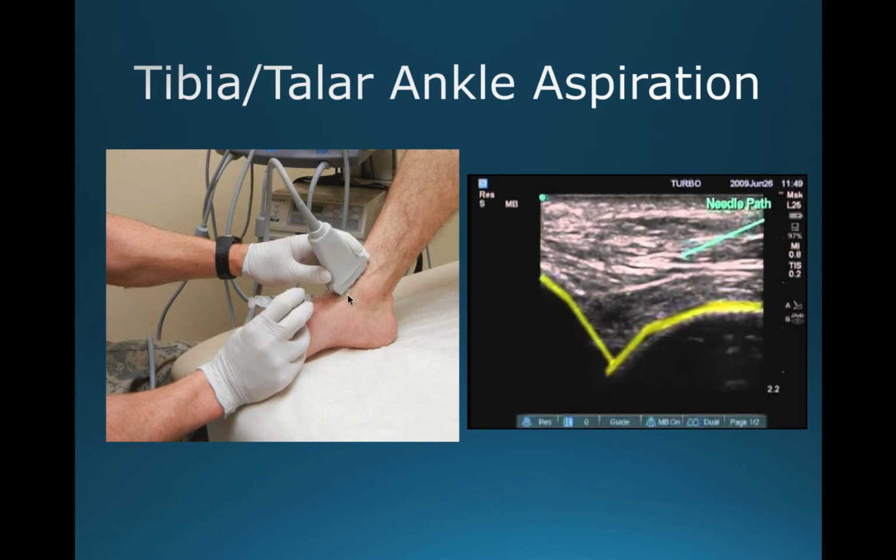Long axis, needle. I'd use a fairly flat probe, and I'll come right in. Needle path is going to be right here. Like I say, for every aspiration, you're going to want to go to where the fluid is at.